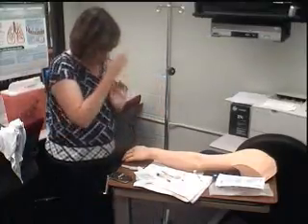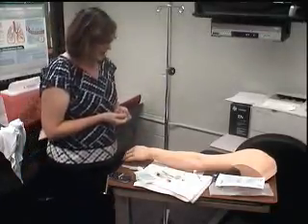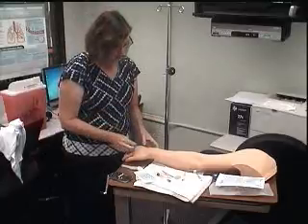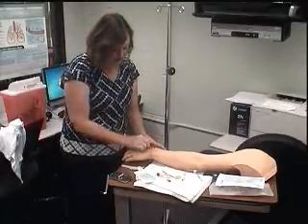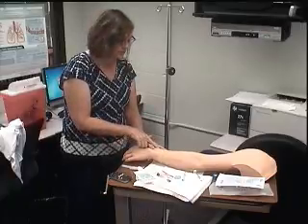All right, so I gather my equipment and I wash my hands. I come in, identify the patient, and explain what I'm going to do. I'm going to go ahead and put a little catheter into your, it's a little tiny catheter. I'm just going to put this into your vein, and this is how we're going to give you IV fluids.